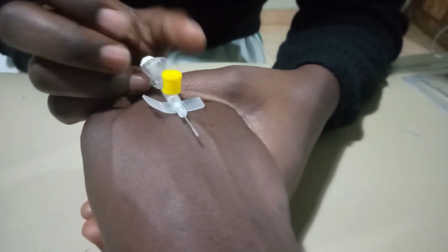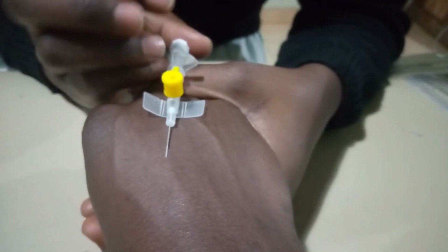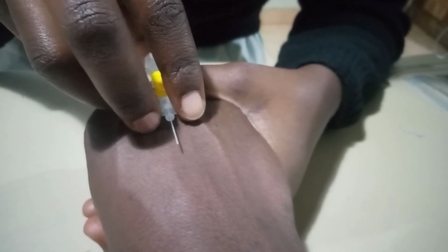If the vein is crooked, there are those veins you find when they are going round, you don't pull the needle out much. So after entering, you don't pull the needle out much. You pull just a little to leave the needle to support, and then you go in. You will succeed.